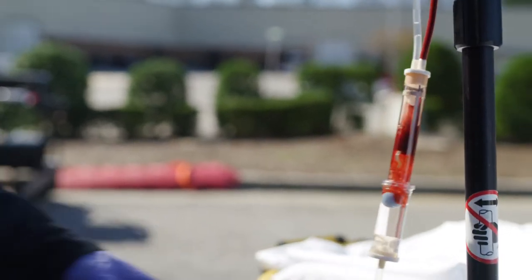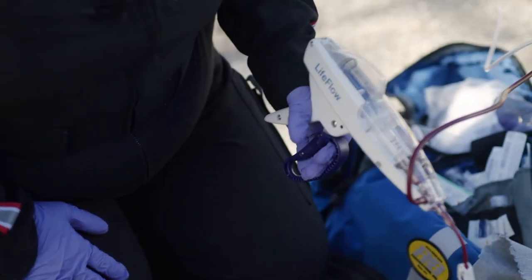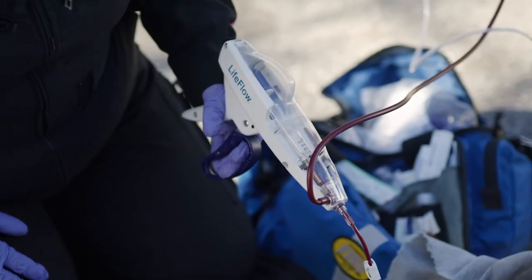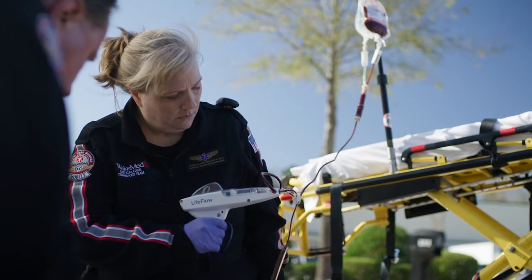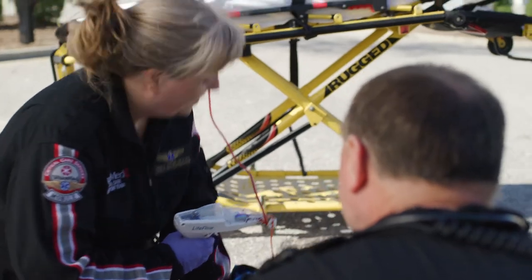Squeeze the air check to prime the blood tubing and squeeze the trigger loop to begin transfusing blood. Each full stroke delivers approximately 10 milliliters, and total volume delivered can be calculated by counting the number of strokes or by noting the total volume remaining in the bag.